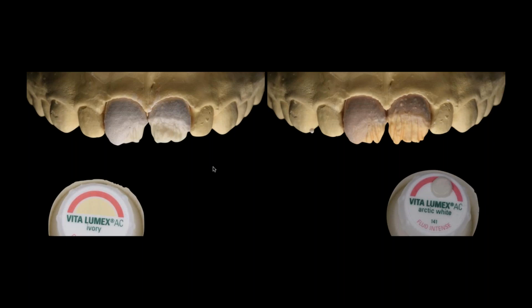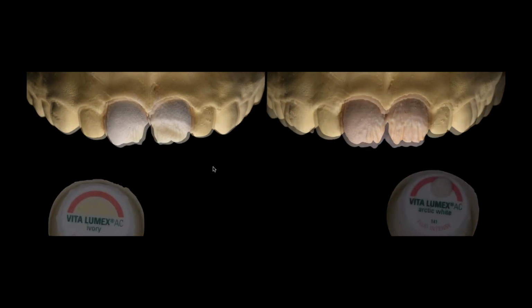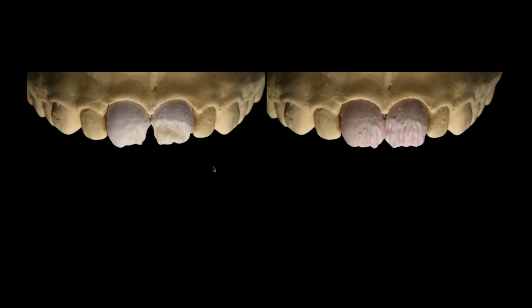Well, I said the advancements are making things better for us. Now I have the ability to actually have more fluorescent powders in some of the newer kits, like the AC kit, where I actually have an ivory fluorescent flow dentin, they call it, which is more fluorescent. It's not technically more opacified, although I think the company would tell you it is really the fluorescence that makes that opacity change. So again, I could use 1 or 2 little powders now. I don't have to do any mixing. It makes life a little easier for me.